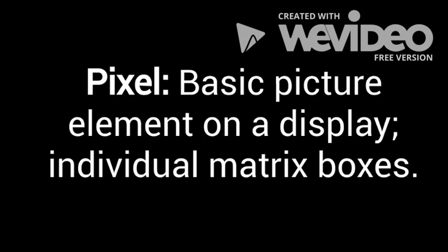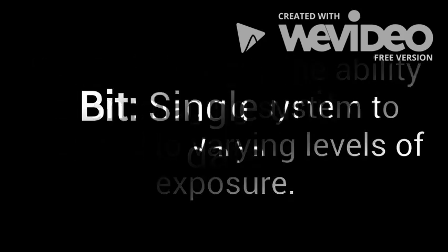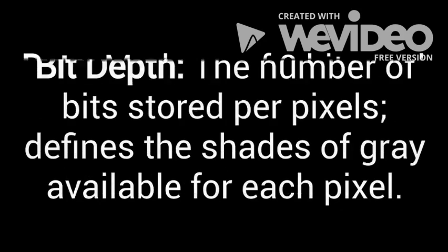A pixel is a basic picture element on a display. Dynamic range is the ability of an imaging system to respond to varying levels of exposure. A bit is a single unit of data. A byte is made up of 8 bits and is the amount of memory needed to store one alphanumeric character. Bit depth is the number of bits stored per pixel. This defines the shades of gray available for each pixel.